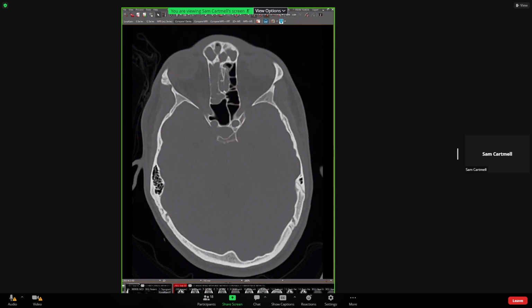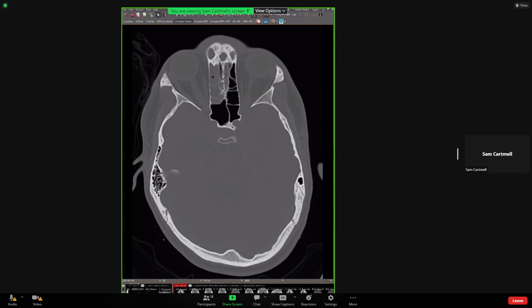And he's got major issues because he's got edema in his brain. So if we look now just on the FLAIR, you can see he's got extensive edema here. And then the most important images would be these post-contrast ones and really the diffusion. So here on the post-contrast images, you see this leptomeningeal enhancement. And then you see on the diffusion images, this is probably a developing abscess.